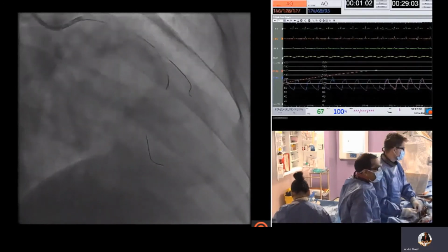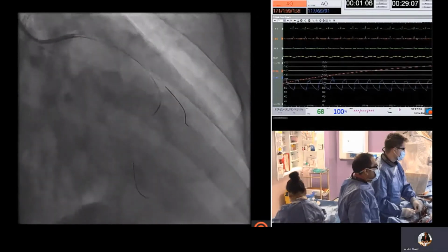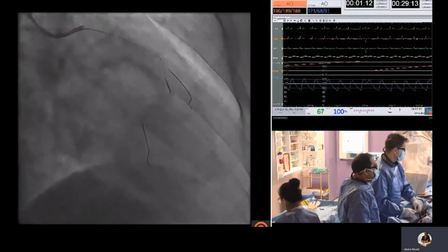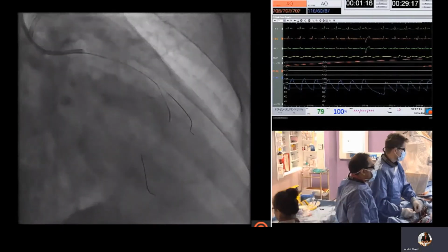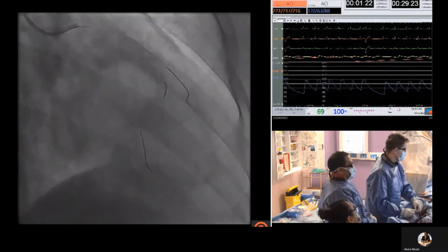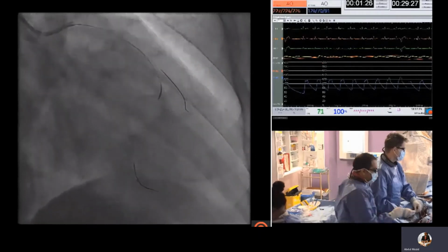The downside of tip injections are occasionally dissecting the septals, rendering them not possible, rendering them useless for crossing. So here, it's not an easy channel into the PDA.